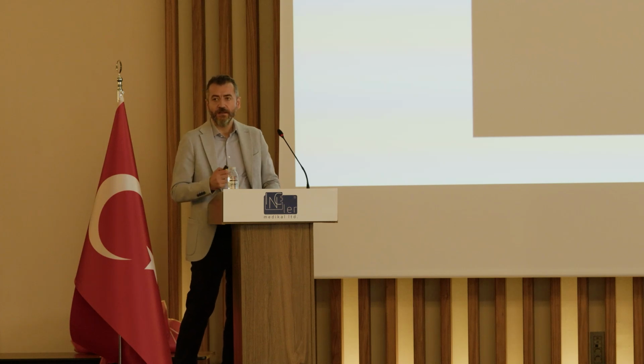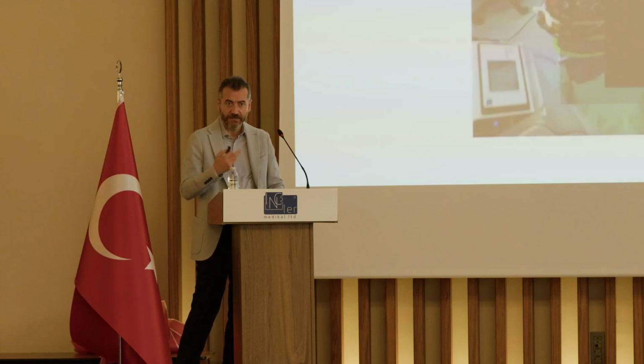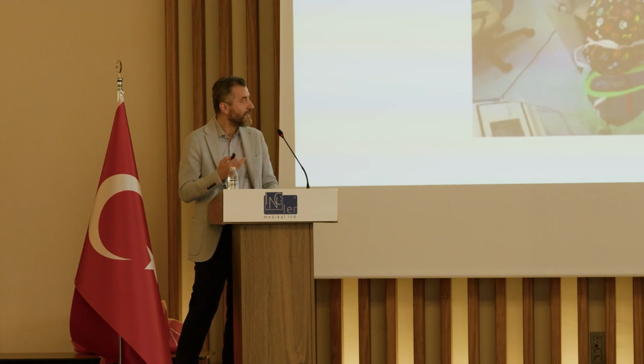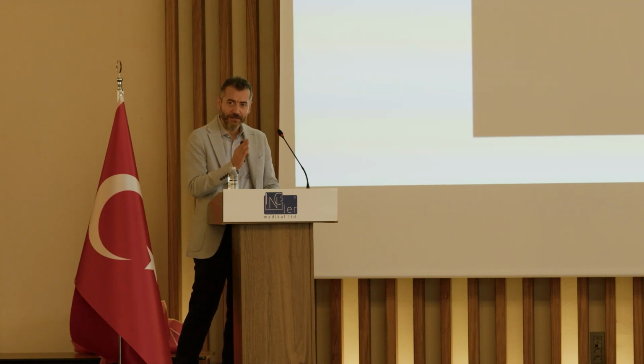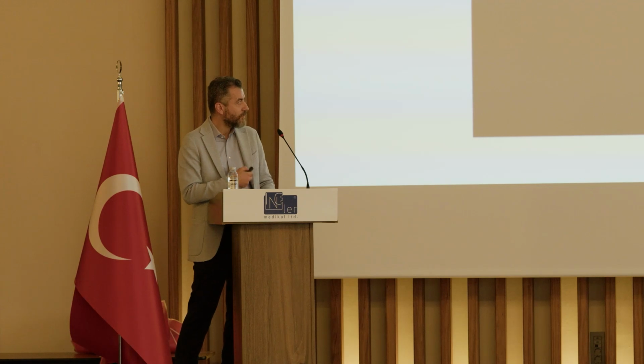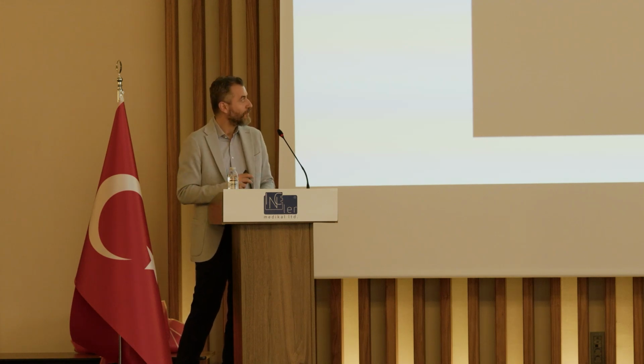During ultrasonic lithotripsy, our main idea is, of course, to suck the pieces out through the channel of the ultrasonic probe. But with such a fine probe, it's not possible to suck out all of the fragments. So the main strategy is to fragment with ultrasonic and then take those fragments out. So we need to adapt our strategy. You see, this is not a very huge stone, but it's also a hard one. It's disintegrated well with the lithotripter, but the suction is limited. In order to have efficient suction with an ultrasonic lithotripter, you need to have a probe of at least 9.9 or 9.8 French in diameter.